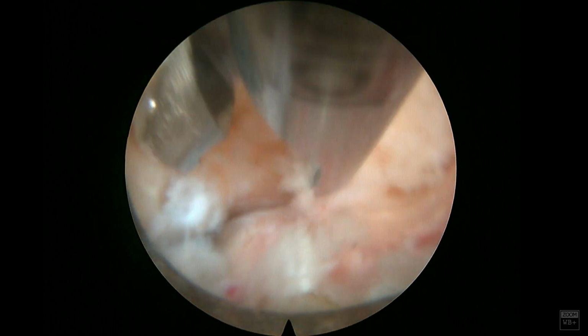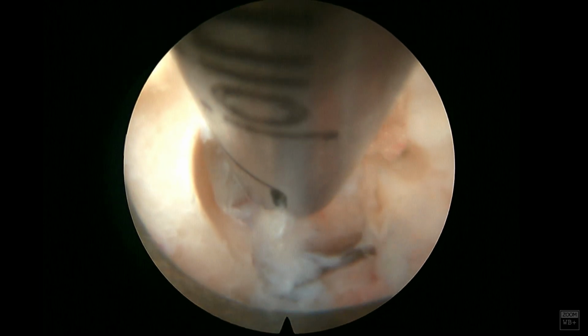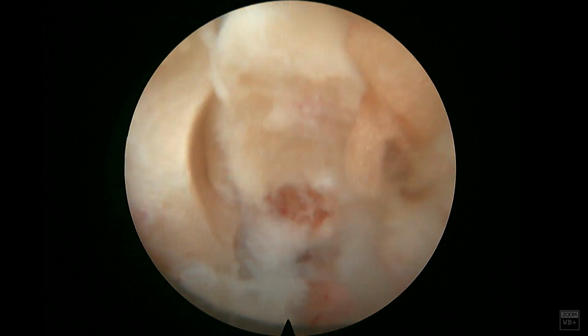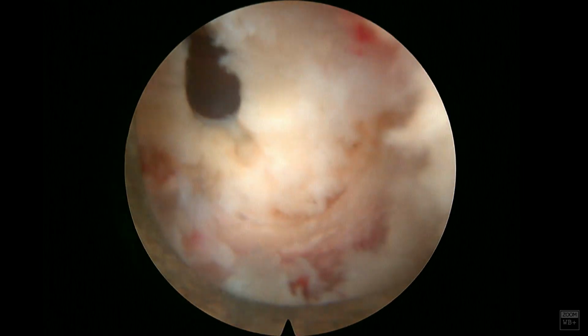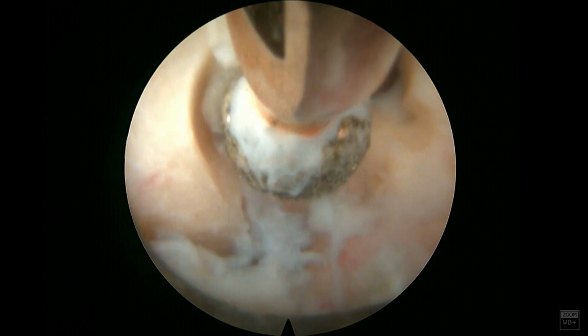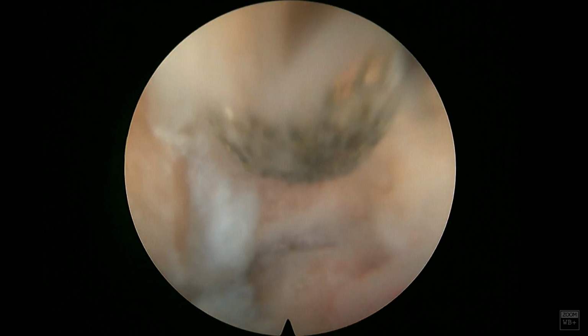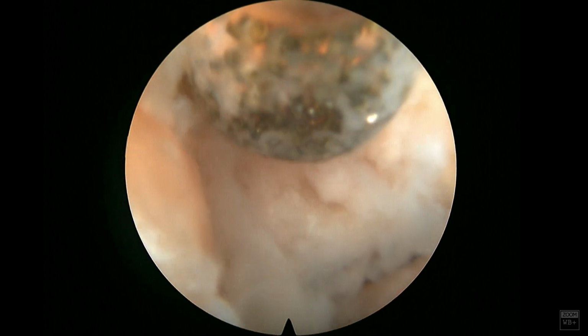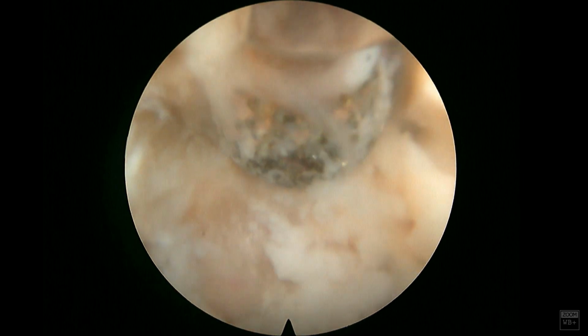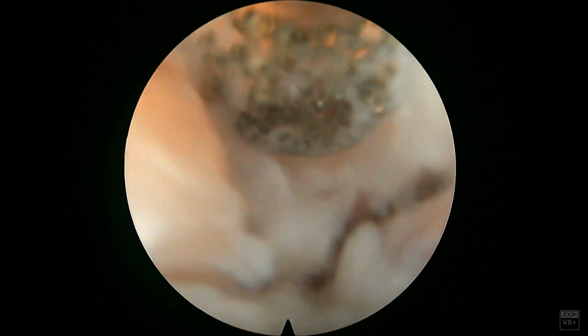You can see some of the joint there, and it's a little bit interesting right here, I'm using a pituitary. You can see a little piece of an osteophyte, and that is essentially what we saw on MRI on the sagittal and axial view of that particular bony hypertrophic facet. And so you can see that I didn't separate it from the inferior articular process of L4, and so this was already annotated to be an osteophyte that was most likely the main culprit of the patient's radiculopathy. So I'm just trying to move it around here and get an idea of the anatomy of the osteophyte.